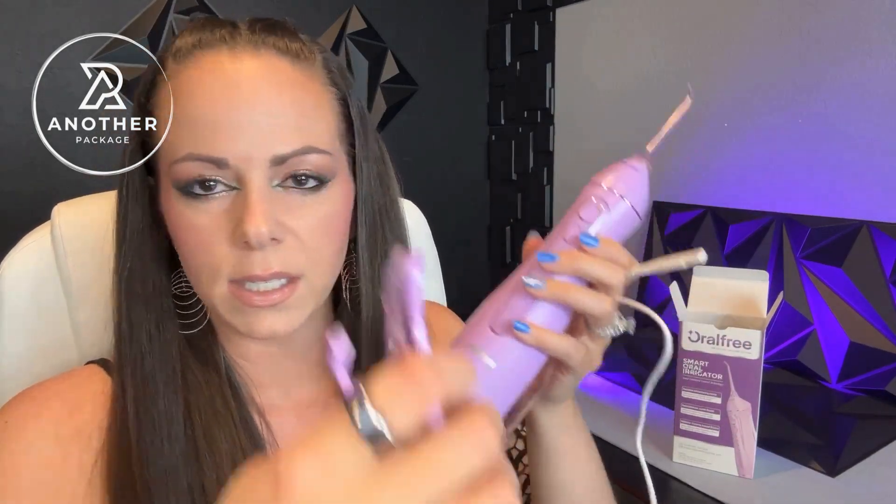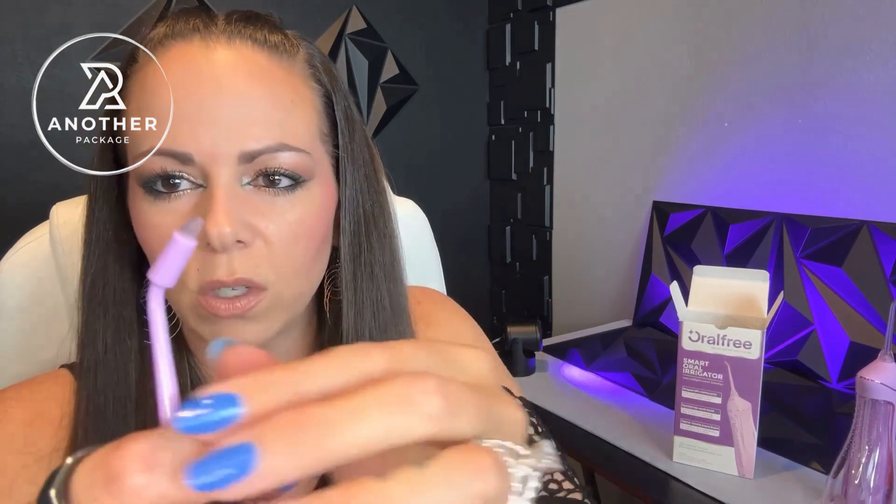My favorite thing about this is it comes with extra tips, but I have used this one the most often. This one has a sort of brush on the end, and I've never used a water pick that has something like this. The reason I love it so much is especially if you eat something that gets stuck in your teeth — it will help you have the water pressure but also scrape everything out. It's worked out really well for me.